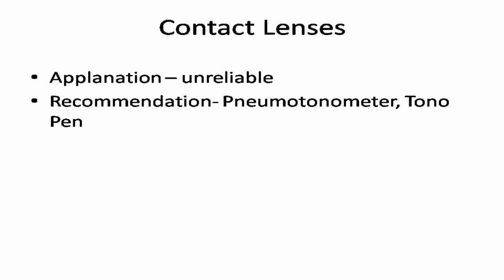Contact lens: applanation tonometry is unreliable, so the recommendation is a pneumotonometer or a Tonopen, which is based on the Mackay-Marg principle.